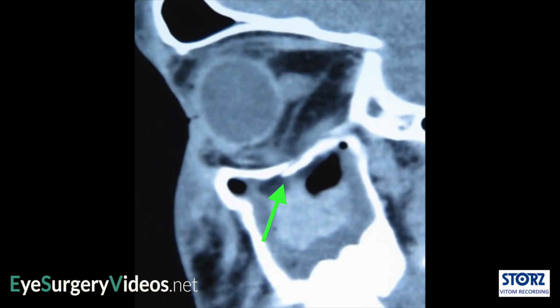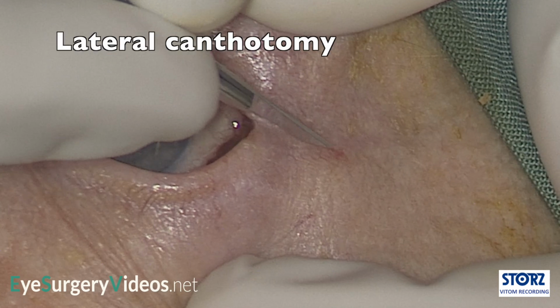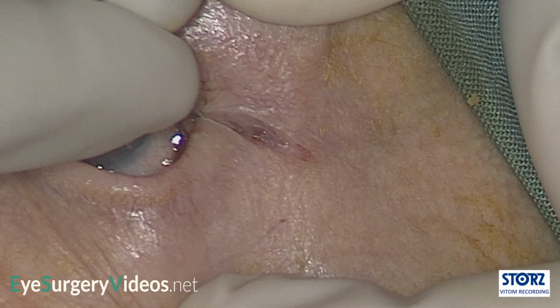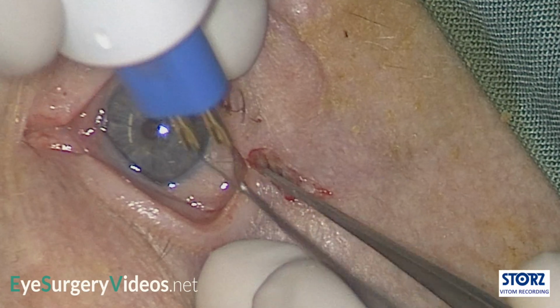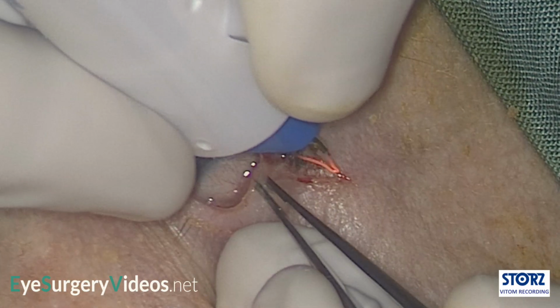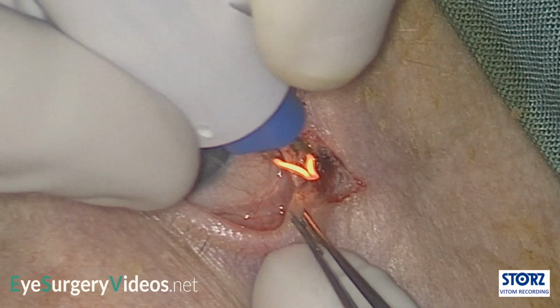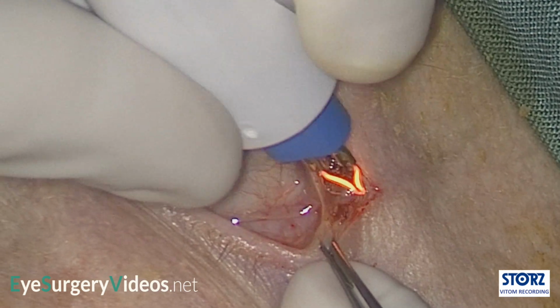This fracture could easily be missed, highlighting the importance of clinical examination, although the presence of orbital contents in the maxillary sinus also confirmed the fracture. The inferior orbital floor is being accessed through a swinging eyelid incision. This conjunctival approach with just a small lateral skin incision has the advantage of minimal or no skin scarring.